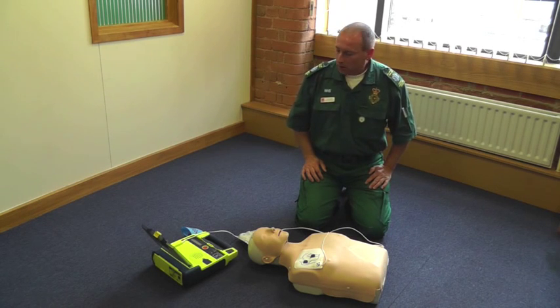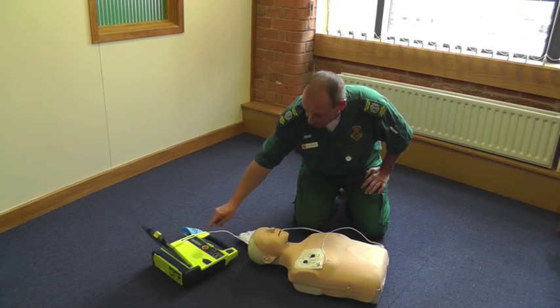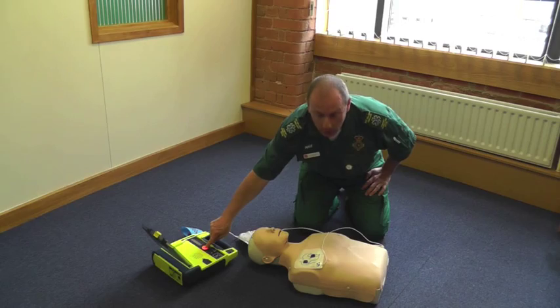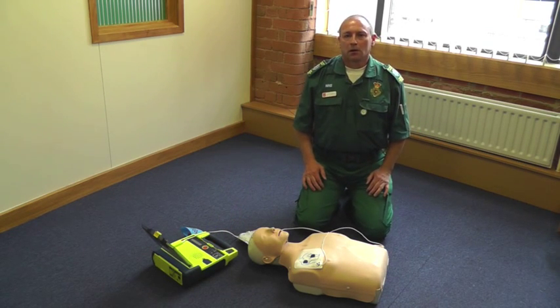Do not touch the patient — analyzing rhythm. Shock advised. Stand clear everybody. Shock in. Push flashing button to deliver shock. Shock delivered. It is now safe to touch the patient.